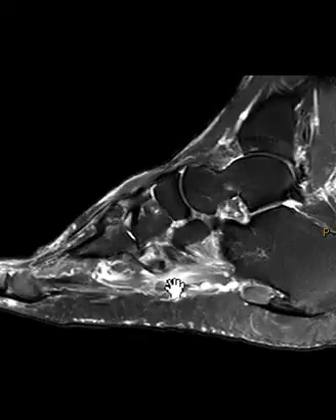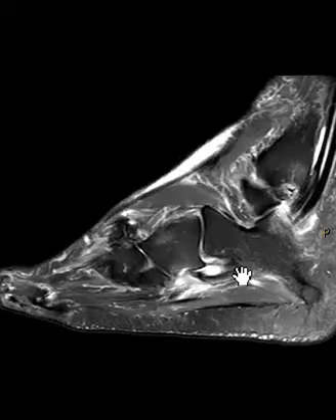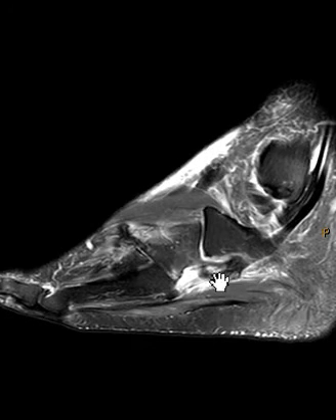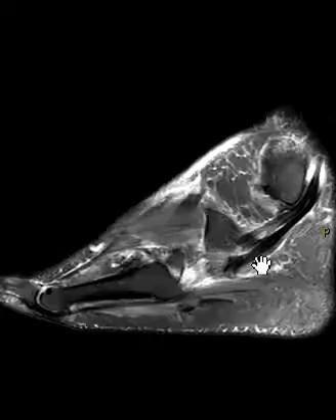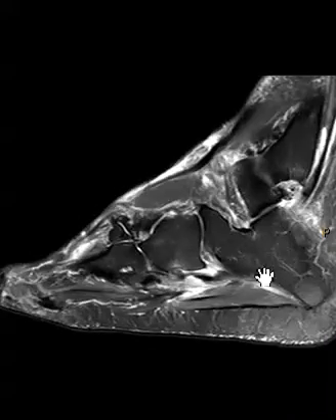So it looks like it is not ruptured, but definitely partially torn — kind of funny looking and irregular, with these areas of fluid signal and attenuation and a little bit of ossification. This may be part of an os peroneum, which is a normal ossification, but this one is larger than expected and more irregular. Usually an os peroneum is nice and well-defined. So this is again a partial tear of the peroneus longus tendon.